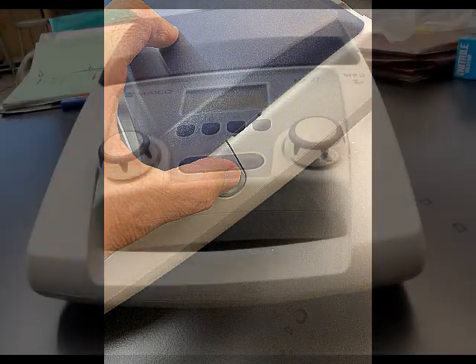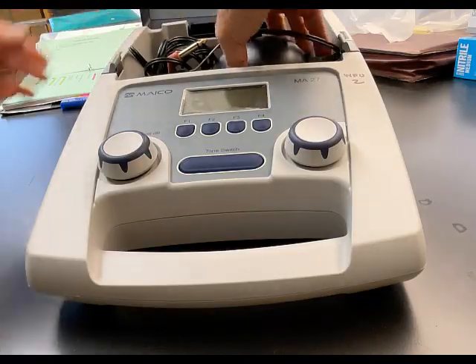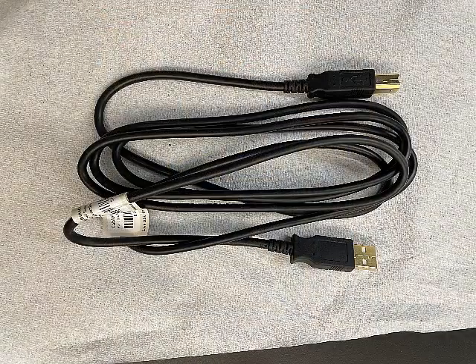Open the lid of the audiometer by pressing the gray buttons on the sides. Remove the headphones, patient response switch, and the USB cable.